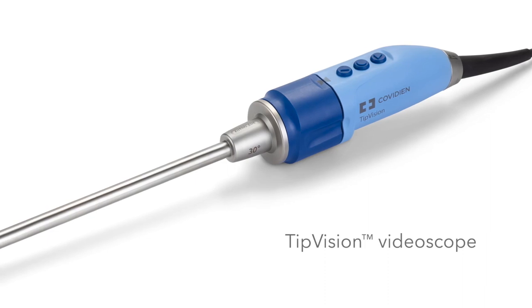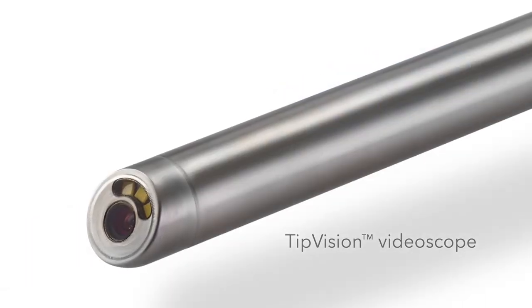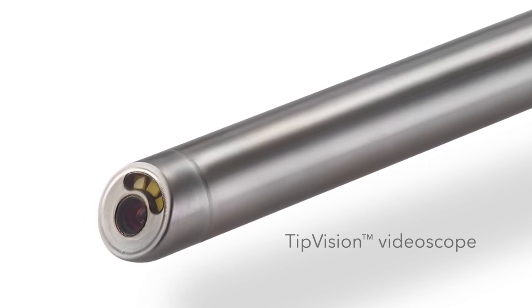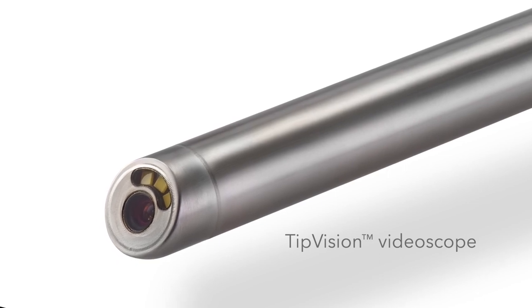The tip vision video scope features dual chip-on-tip technology. The distal end of the video scope features a distal CMOS sensor, integrated LED lights, and a scratch-resistant sapphire glass cover.